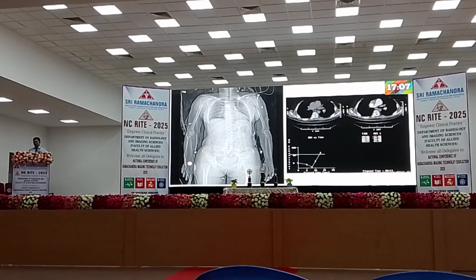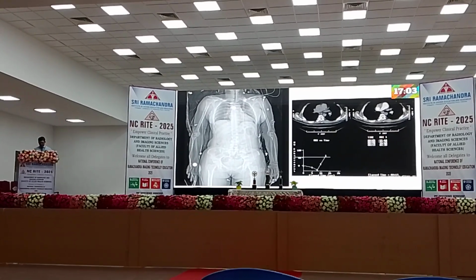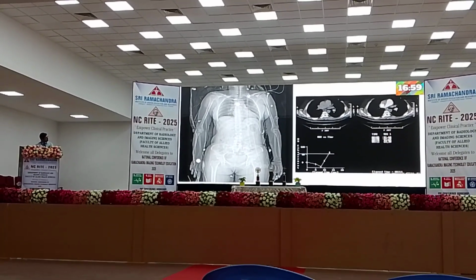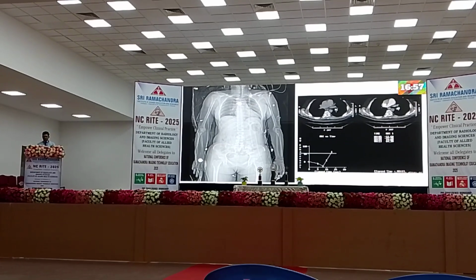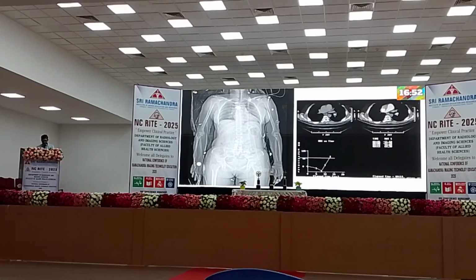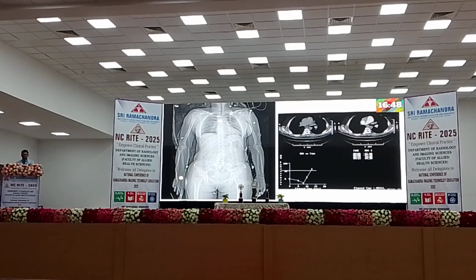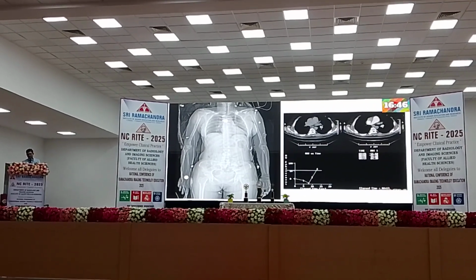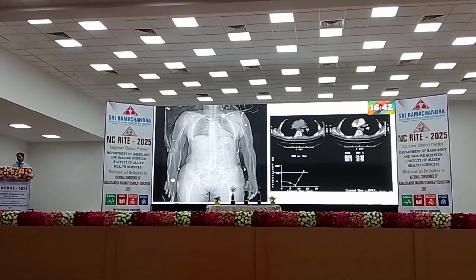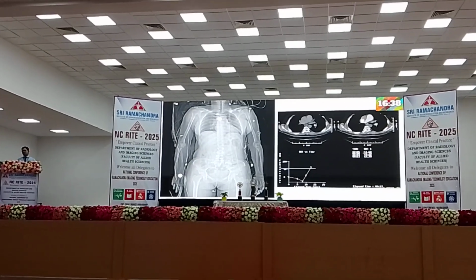Okay. See, before I start my session, I'll give you one example. See here, the patient is lying down. We have placed the cannula here, and we also placed the tracker. Or initially we place a localizer or locator, and we do the tracking. So you might have heard about bolus tracking, right? In GE it is called Smart Prep. In other modalities it is called bolus tracking.